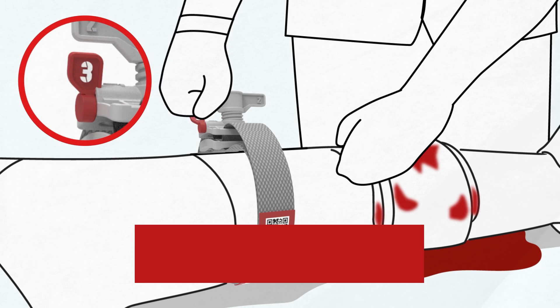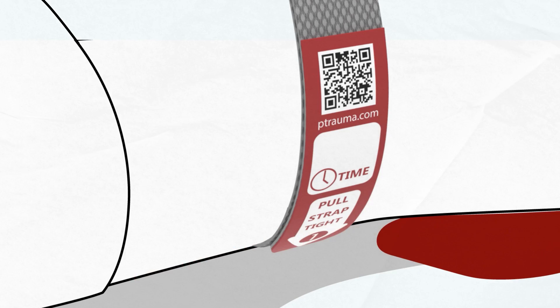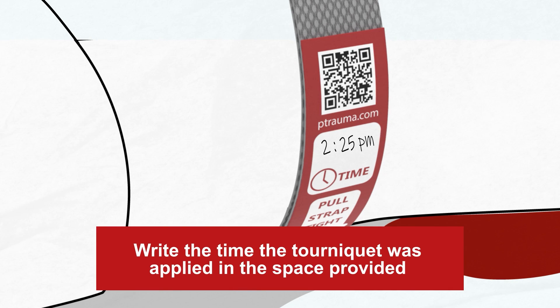Step 3. Turn the locking tab marked with a 3, 180 degrees clockwise to lock the handle. Mark the time on the space provided on the end of the strap.